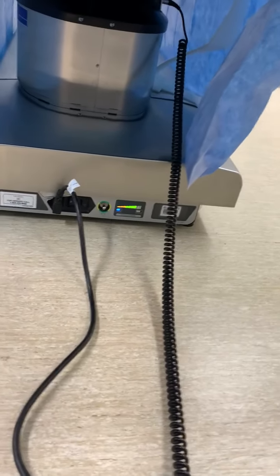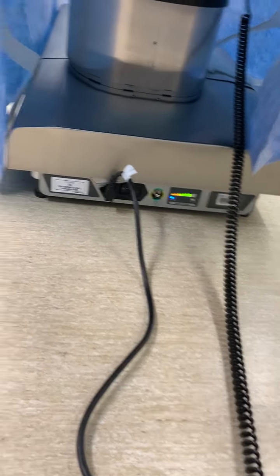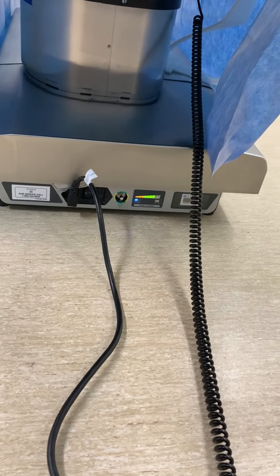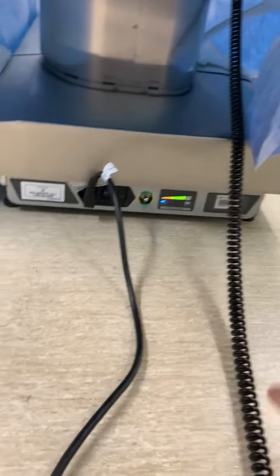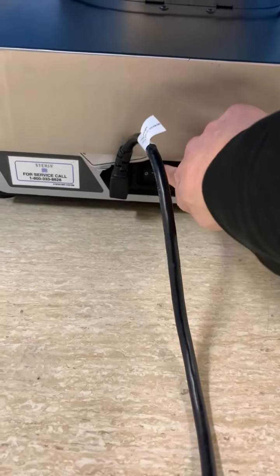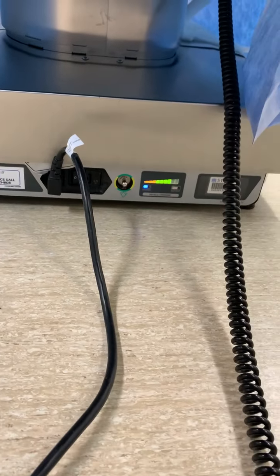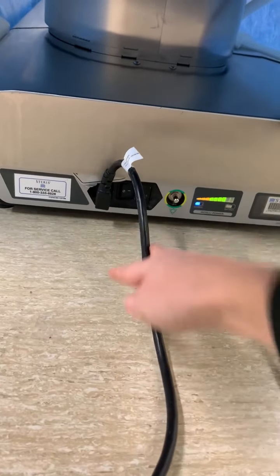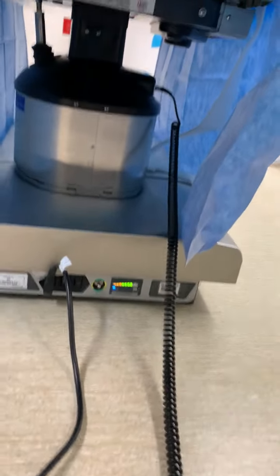Another thing is if you're having issues with the bed — Whitney said that sometimes this little toggle switch down here, the on and off button, sometimes doesn't get turned back on. So maybe check that switch, or make sure this is plugged in, because sometimes that's the reason that the bed isn't working.